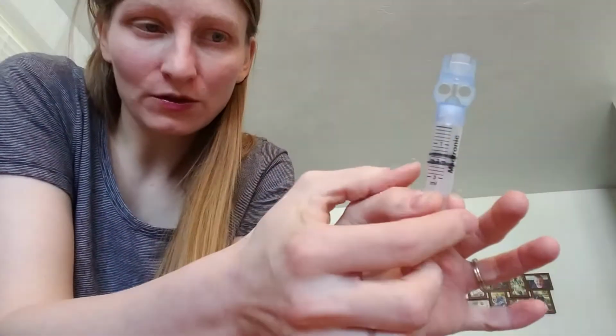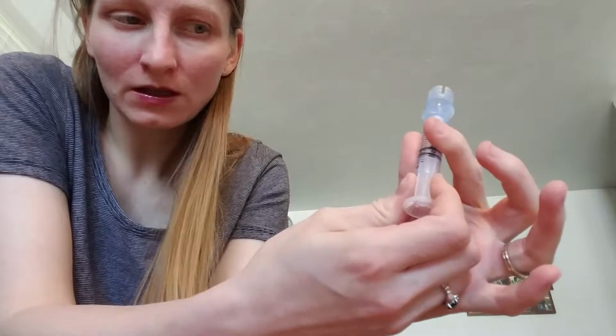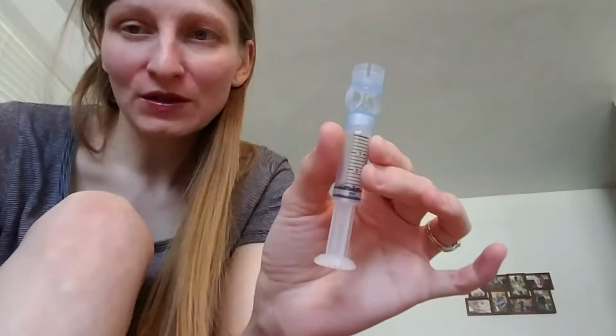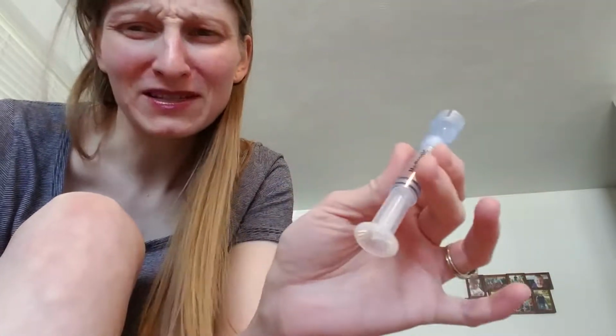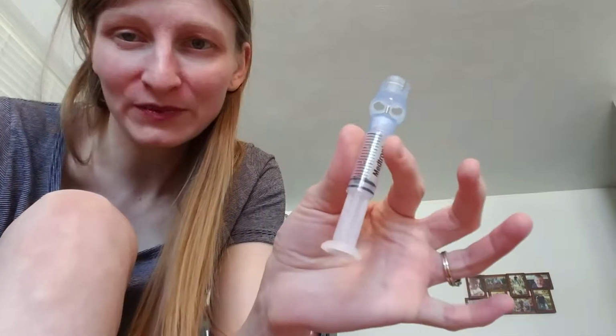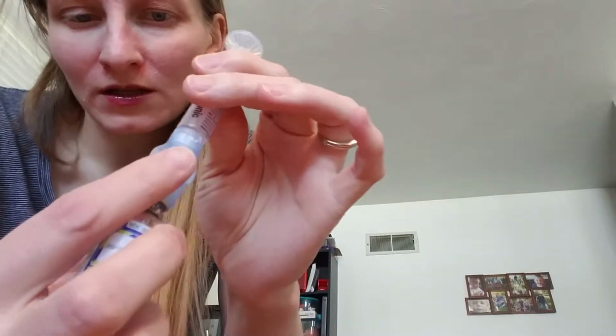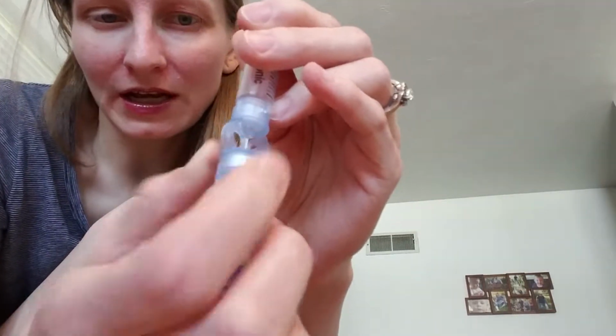So first thing I have to do is fill it with air. You know you're a diabetic if you do this when you're giving your infant Tylenol. You fill it with air first before you withdraw it with the little dropper syringe thing. Doesn't really help with Tylenol, but it's habit because I have to do it for this. Fill it with air, and this helps decrease the amount of bubbles that I have in it.